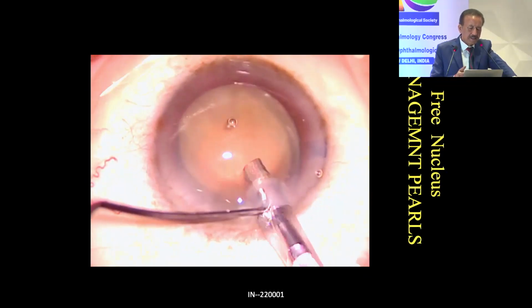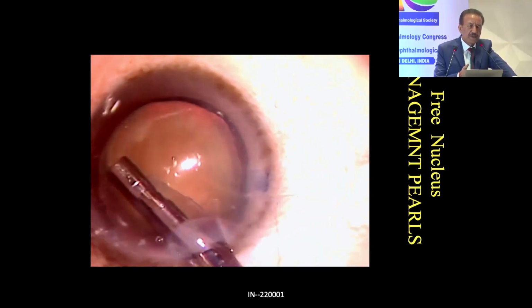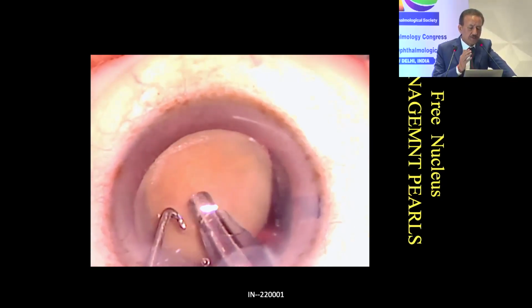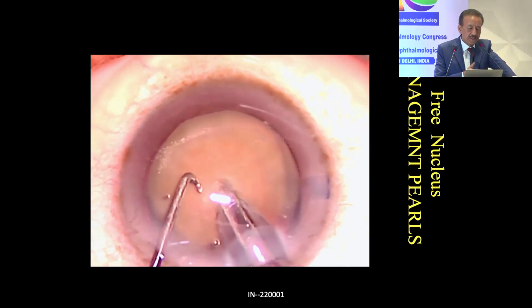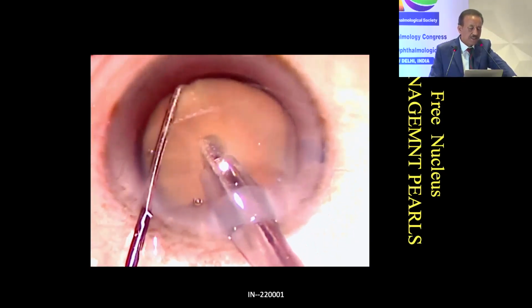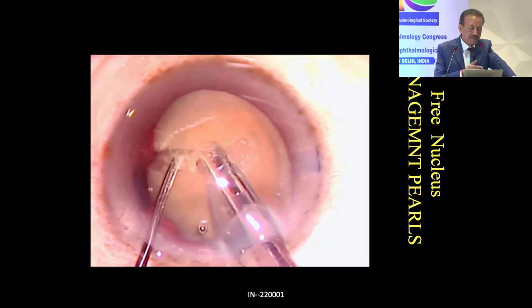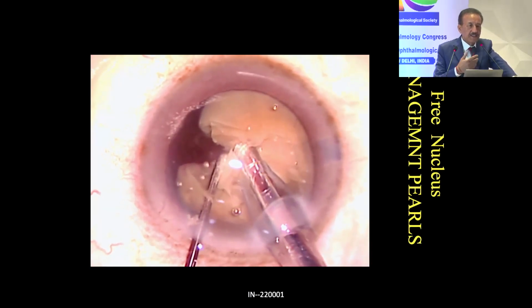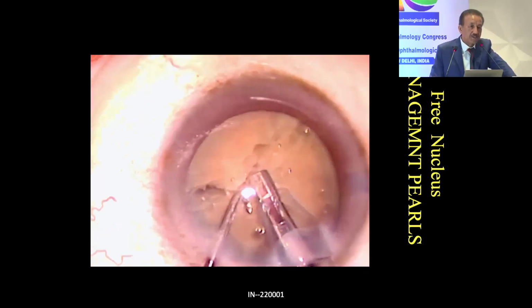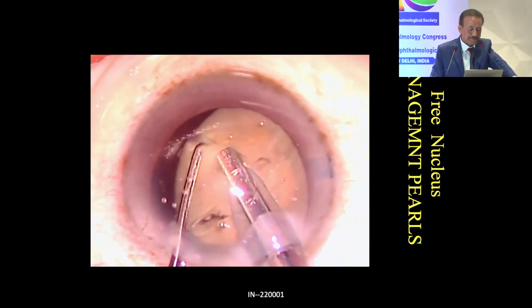This is another floating cataract, absolutely hard. Normally nothing will work in this case. You can't do horizontal chop or vertical chop in these cases. But here you can do the terminal chop technique. Just hold this from the center, go around it, and then crack it. You must be doing this technique many a times, but if you use this device, then you can have a much better cracking of these nuclei also, and you can very simply complete the surgery.